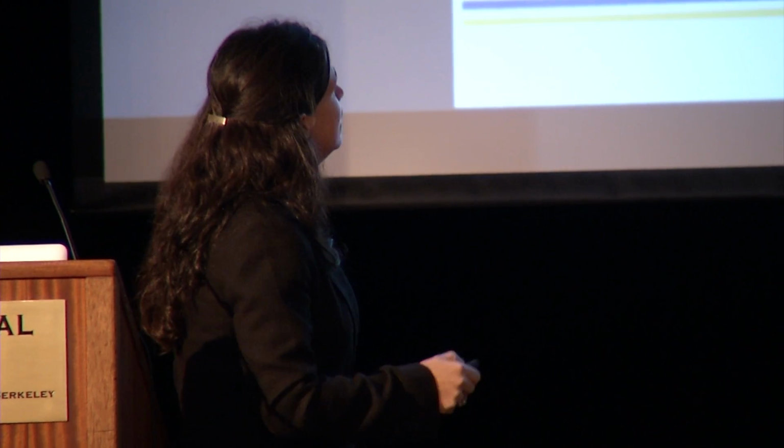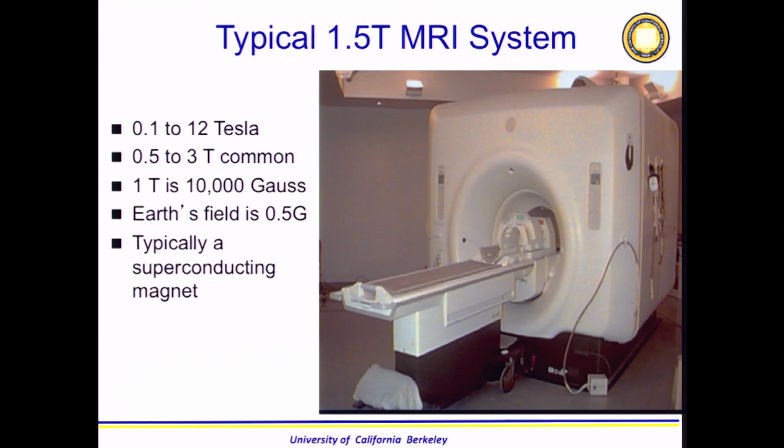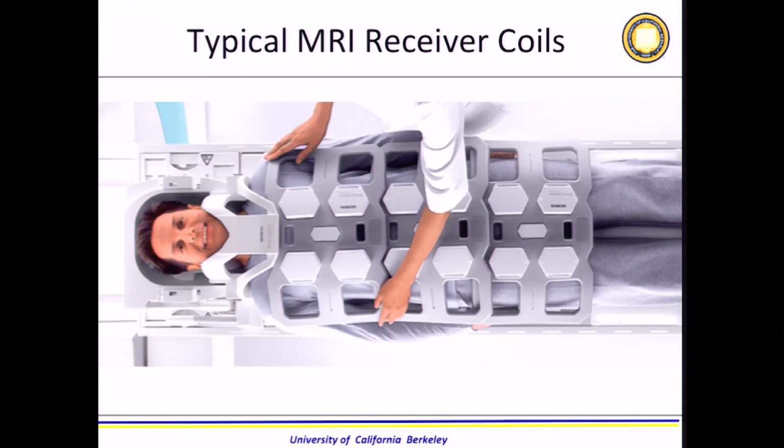First, let me give a disclaimer. This is an MRI machine. When you go and do an MRI, you lie down here. Here is the big magnet, and on the table there are RF transmit coils. This is not what we are making flexible. You still have to go through the tube into the big magnet. But when you get prepared for an MRI, this is how you look.